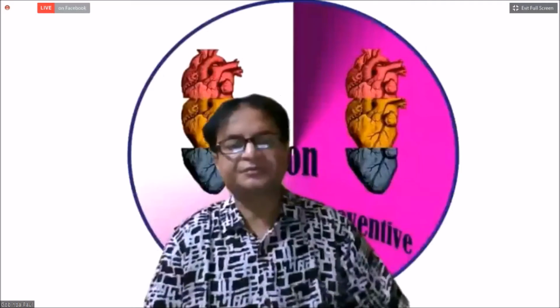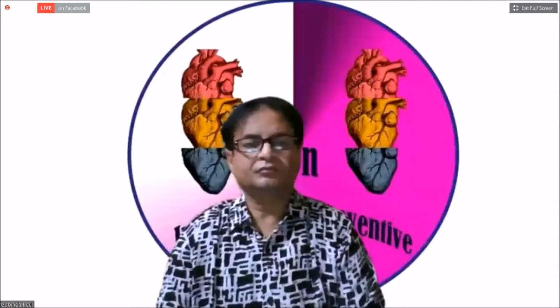And isolated hammocking may be a normal feature without prolapsing of the tip of the mitral valve. So hammocking and billowing may be relatively benign features, and these do not fulfill the criteria for the diagnosis of mitral valve prolapse.